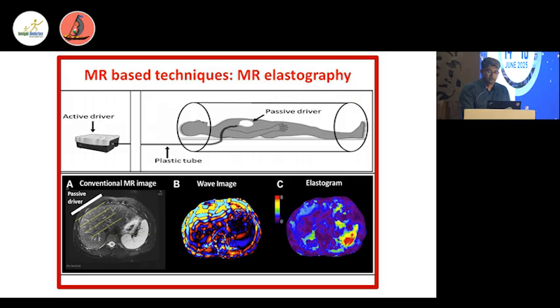So that means that to cover the same distance, same depth, in F0 fibrosis it needs this much time, in F2 fibrosis it needs lesser time, and in F4 fibrosis it needs minimum time. So the distance is the same, the time taken to cover the same distance is decreasing. That means the velocity is increasing as the degree of fibrosis is increasing.